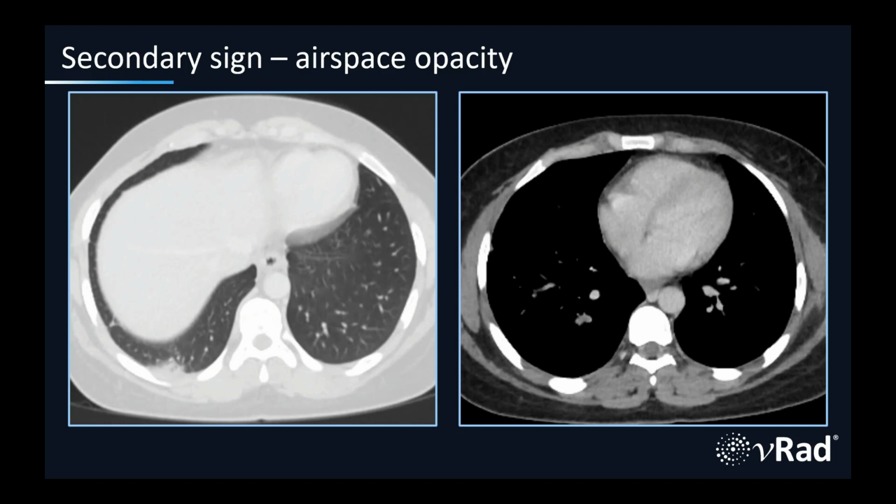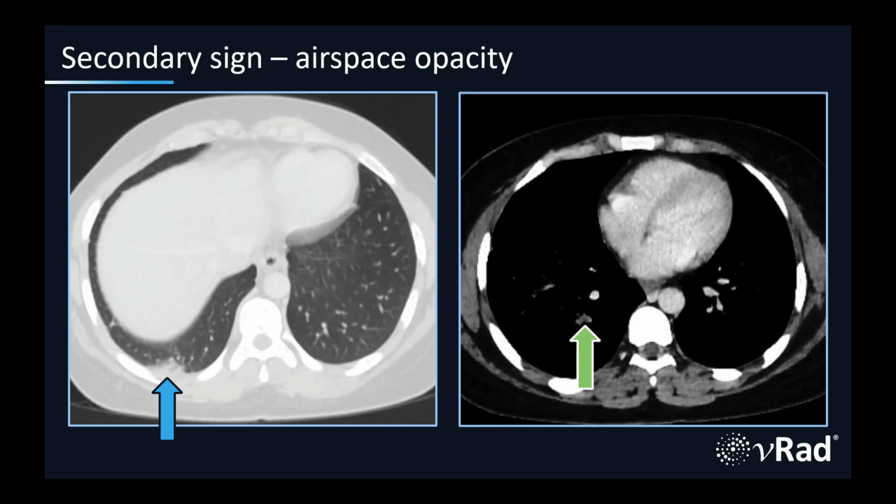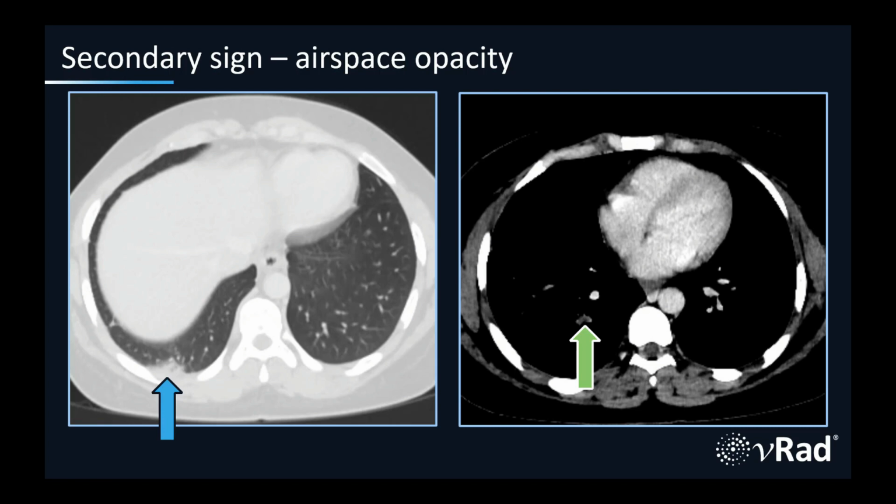And this is a different patient. The finding is in the right lower lobe posterior base, this peripheral wedge-shaped airspace opacity that alerted the radiologist perhaps that's a pulmonary infarction. Let's look at the pulmonary arteries in the right lower lobe. It was a contrast-enhanced CT, but not a CTA. If you look at the pulmonary artery denoted by the green arrow, you can see it's subtly hypoattenuating relative to its companions on the contralateral side. If you put it on liver windows, you can see that low attenuation filling defect there, confirming the pulmonary embolism in this patient.